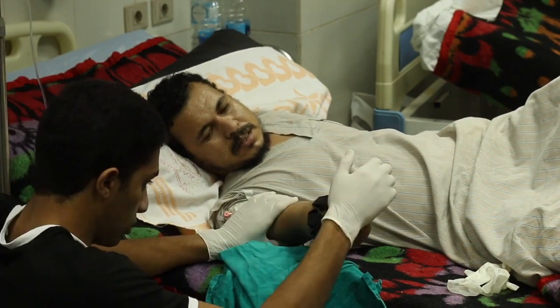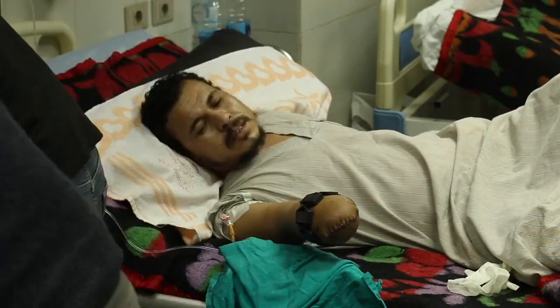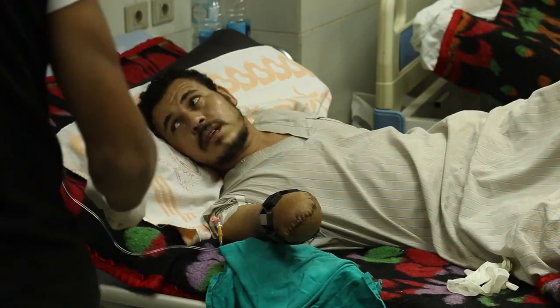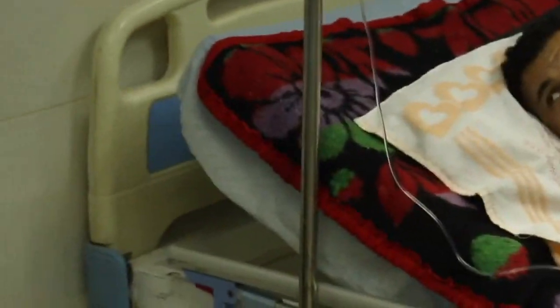The main idea behind this project is to develop a below-elbow prosthetic arm that can be controlled through EMG signals, gathered through a myo-armband sensor, so the patient is able to control the prosthetic arm with the signals used to control his normal arm.